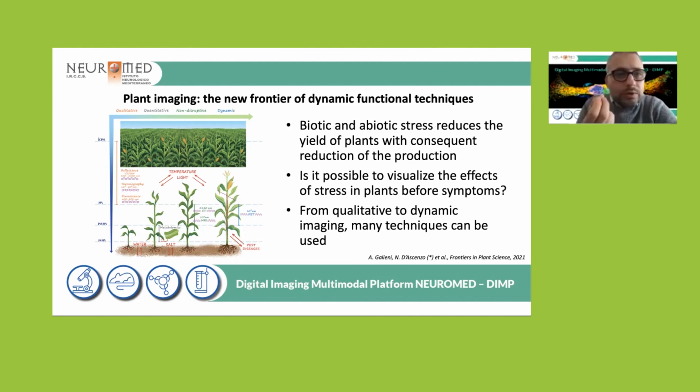And the key question is if we can visualize the effect of this stress very early, before any symptoms occur. So again, early diagnostic. From qualitative dynamic imaging, many techniques can be used. In fact, we summarize it in this picture: the many imaging techniques which are already used in agronomy to check this problem.